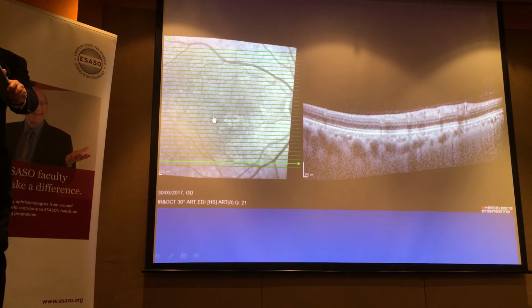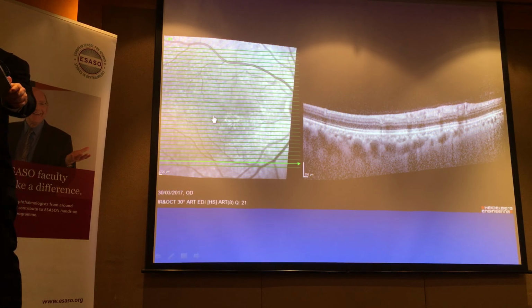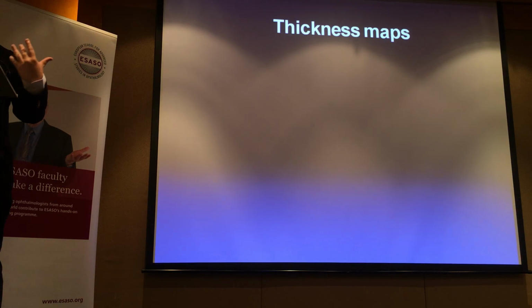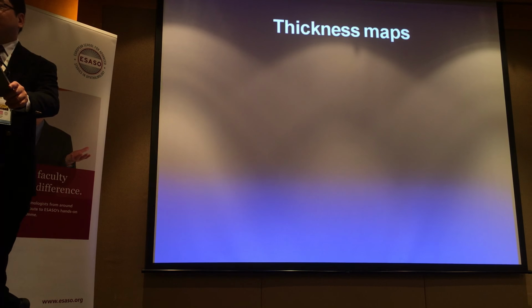Which of course explains why 31 scans is usually not my favorite, although I know some technicians will disagree with me and hate me for this one. Alright, any comments so far? These are some of my thoughts and experiences, it doesn't mean that it's entirely right, and you may have different ways, or you may want to go further or say, nah, let's not do that. Please feel free, or we can talk about it during Q&A as well.